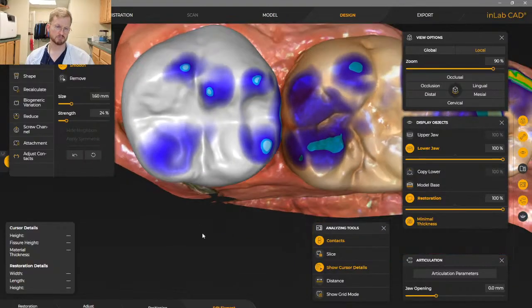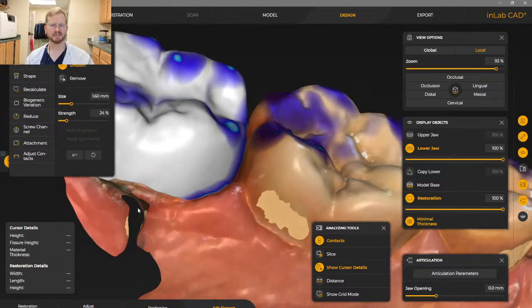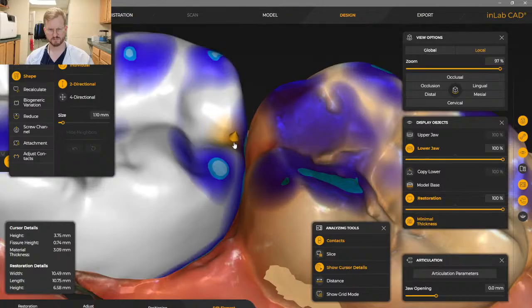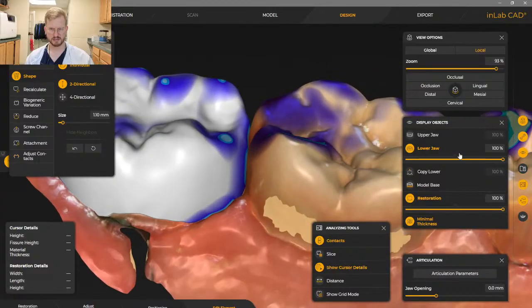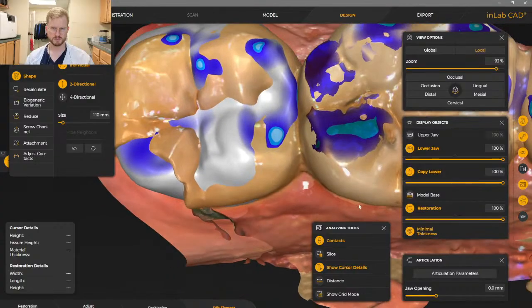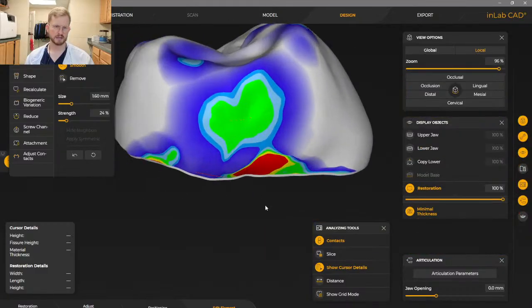Contour. Do we love our contour? Yeah, I think it looks fine. Okay with the shape of that tooth. Marginal ridge height. A little inadequate. We could try and bring this up some. Let's see what we did have. Yeah. So he's already got more marginal ridge than he did have. You can see mine's coming through. His old tooth was, so that I'm going to be okay with. Should be fine. So contour looks good. Contact is the last C.